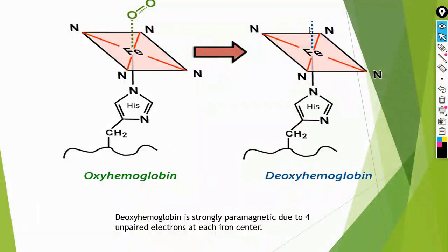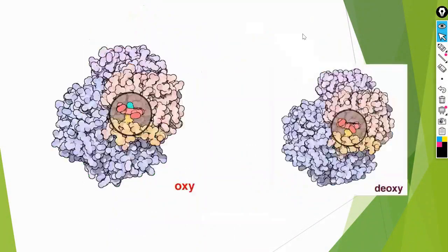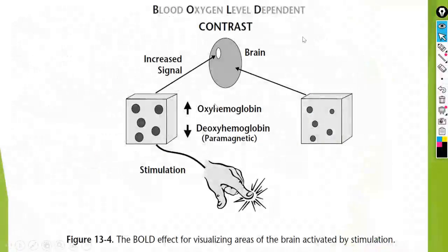This affects the image. The areas that will be impacted will indicate activity. This area is bright, meaning it is high, which indicates that it is higher than the rest of the brain areas that are not active. This is exactly what I observe in the brain, where there is an increase in the result due to an influencing factor that enhances this area.